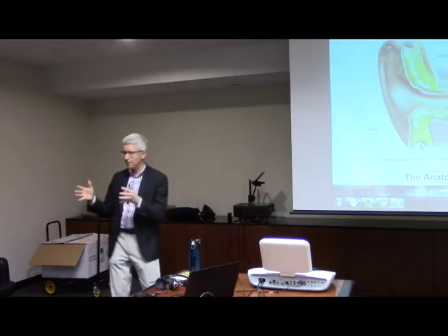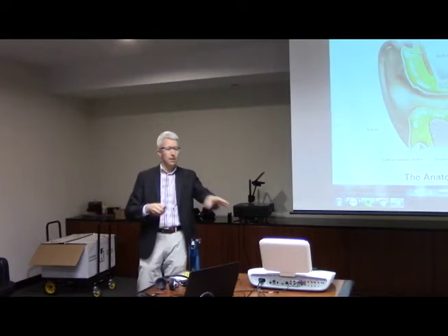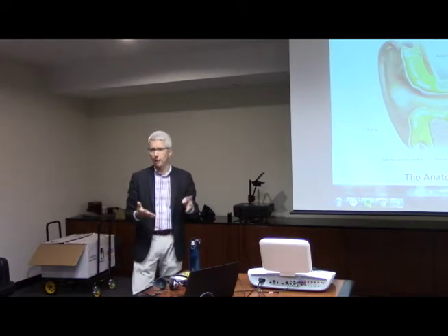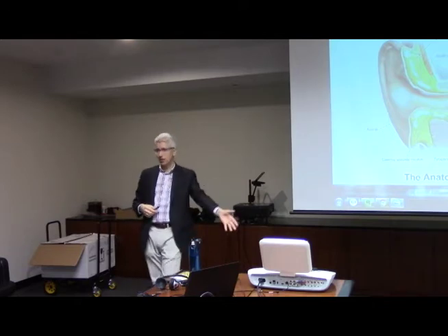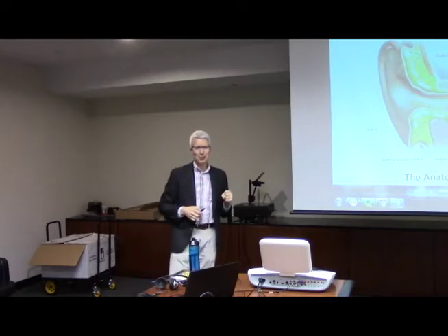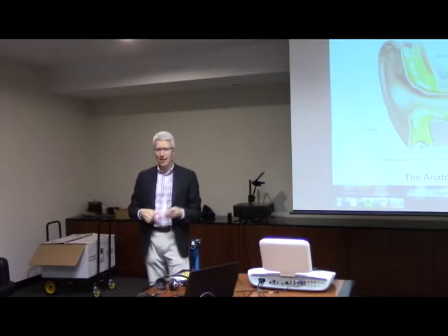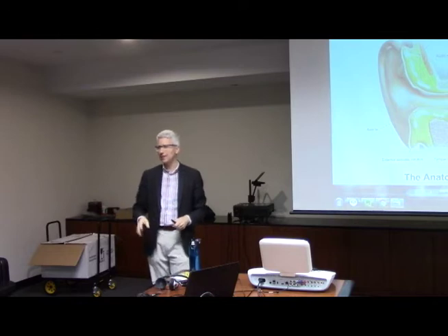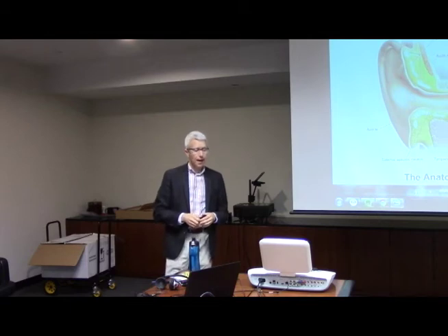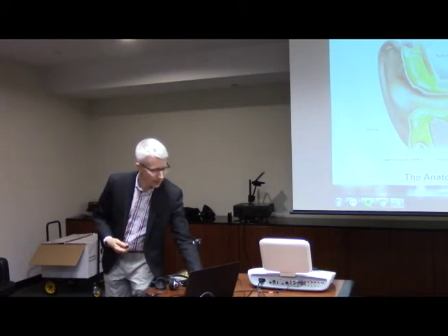But it's challenging, so you can't go back and forth real easy, you can't hop around in words. Even with MP3 players, it's more challenging, where here, I'm seeing what I'm doing, I can click on a word, I can move to the next one, I can go back and forth, I can repeat words. So with it built into the audiometer, this is starting to catch on, although audiologists, we're stubborn. We don't like to learn new things, we don't like to change the way we do things. I had a long conversation with 4 audiologists about this yesterday. They're saying now, yes, we're gonna do this, and I'll bet when I talk to them in 2 months they haven't done it. But old habits die hard. There are different ways to present those words. The best way is recorded, monitored live voice is the alternate.